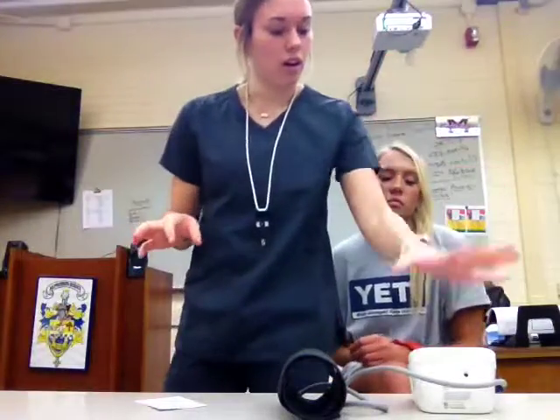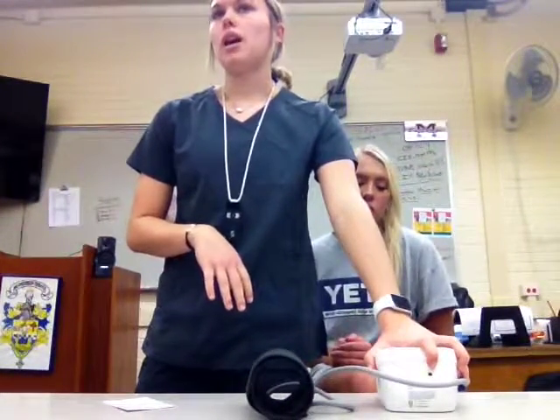Moving on, the next vital sign I'm going to show you today is blood pressure. This can be one of the trickiest to learn just because it's hard to learn and it can be very inaccurate sometimes. Today I have an electric blood pressure cuff with me, but I will show you and tell you how to use a manual cuff while I'm showing you how to do this.